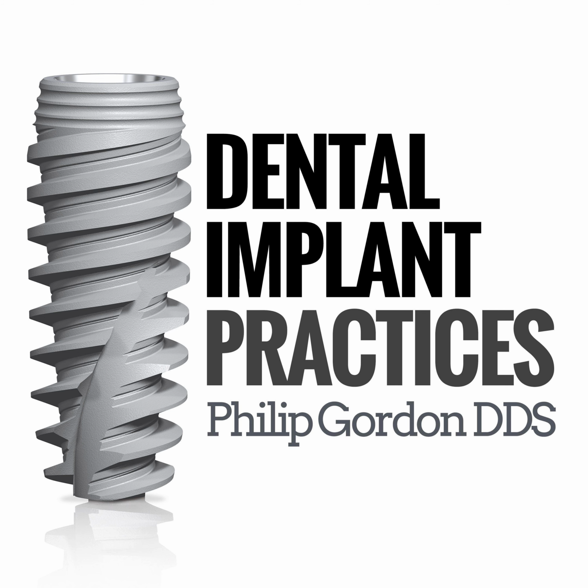You're going to have post-op checks anyway, so do the bite adjustments after everything goes down, because it's surprising how off it looks the day of surgery. They come back 2 days later and it's perfect. Yep, so you got it. That's definitely something to remember, because if you start whacking on that occlusion, they come back in, it's going to be different a couple days later.